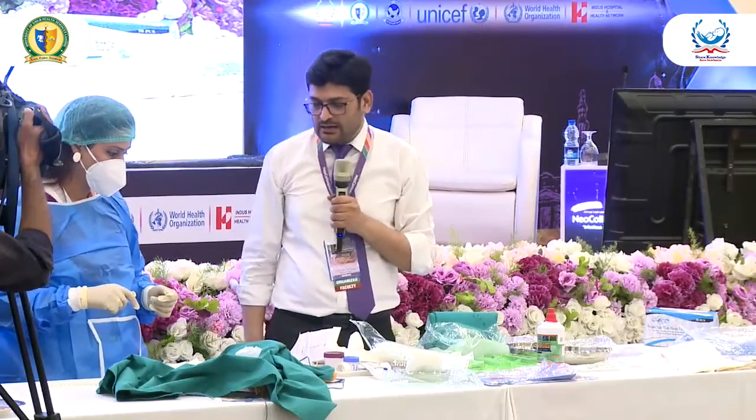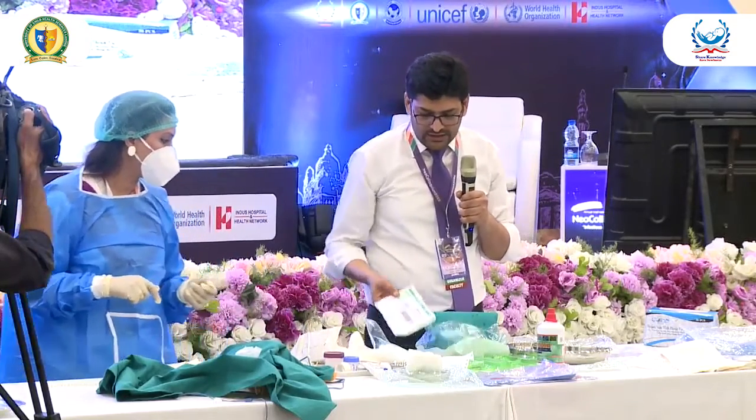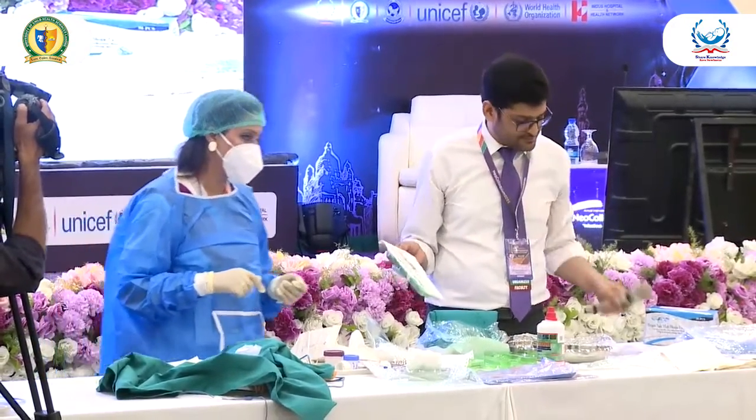Now we are supposed to draw up the catheter, and we are about to prime that catheter with heparinized solution.